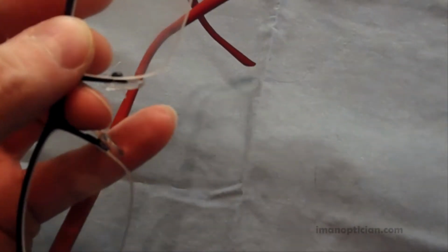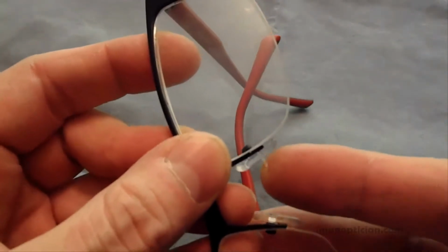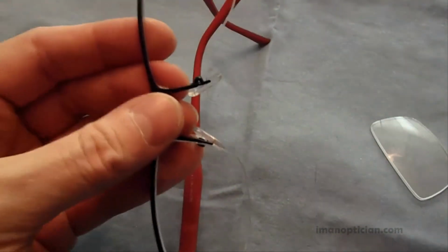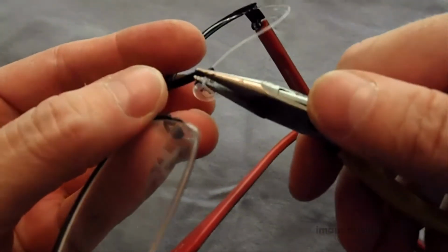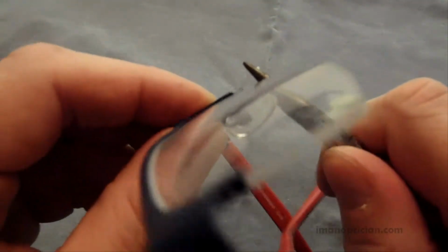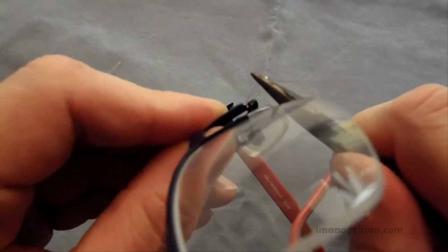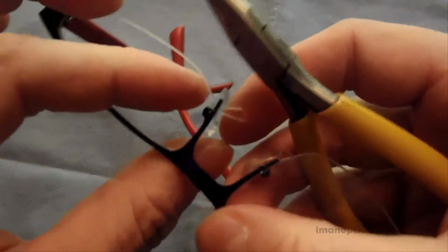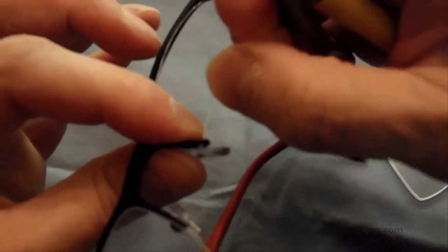You'll get to know how much you can leave on there. So I usually like about that. That's a little long, but you can always tighten it up. Now when you push this through, you'll see this crimp, and now we're going to use our pliers, because I don't have nice little fingers to push that in, and go in again through that top hole and push it up to the point where that crimp is. Bend over your tag and then pull this nice and tight.